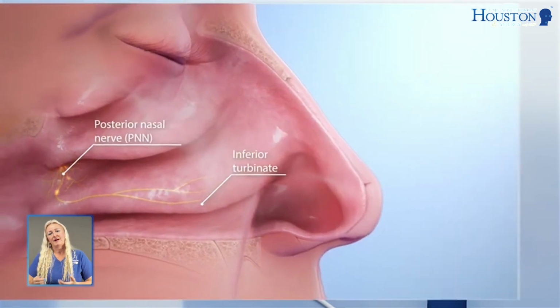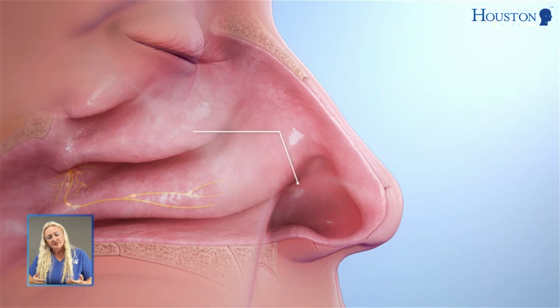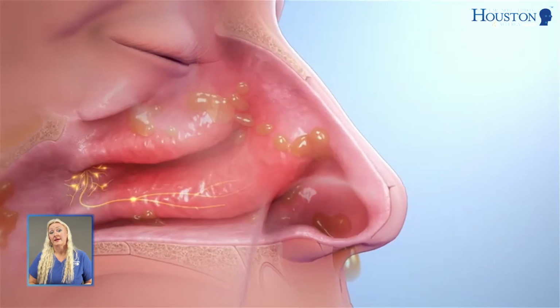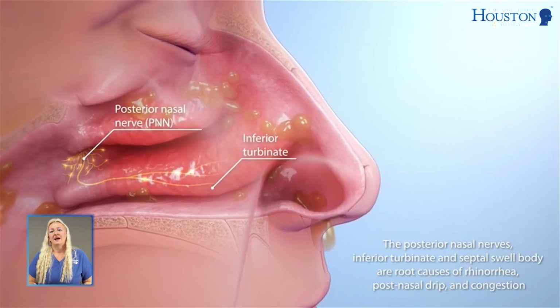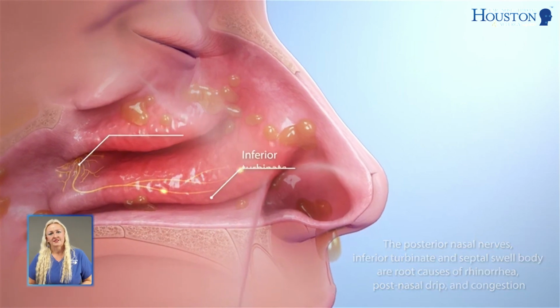And also at the back of the nose, there is an area, a nerve, which is called the posterior nasal nerve. It's basically a center at the back of the nose that's making you drain. That's giving signals for your nose to produce all the mucus. In a lot of patients who have allergies, this obviously is very hyperreactive. And so the way I describe this to patients is this procedure will calm down the nerve that's basically misbehaving. So how does it feel during the procedure?